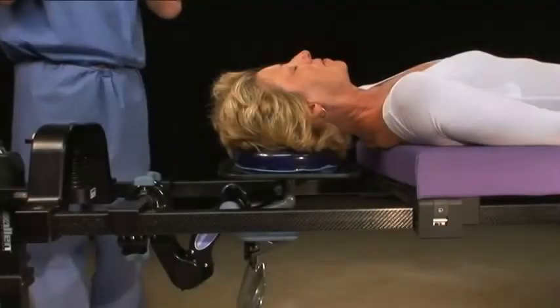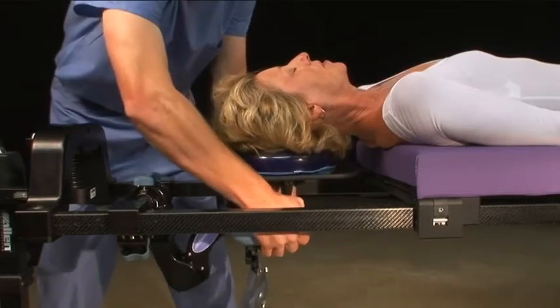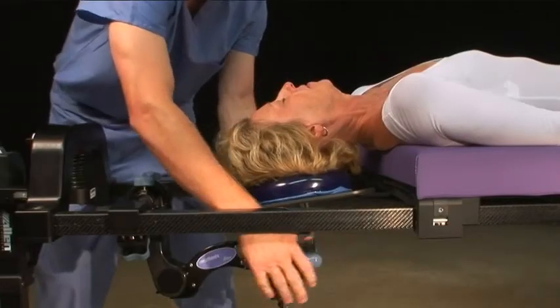The C-Flex in combination with the supine tops creates a platform for anterior cervical procedures. The patient's head and neck can be flexed, extended, and rotated for procedures such as discectomies and artificial discs.